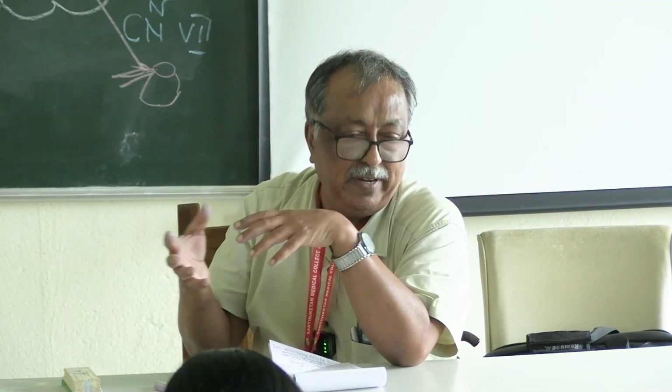If the nerve damage is not repaired, the facial paralysis needs some intervention. It can be ascertained by the stapedial reflex. If the patient has gained the stapedial reflex again, that means there is a progressive repair automatically going on and the facial nerve damage is repaired.